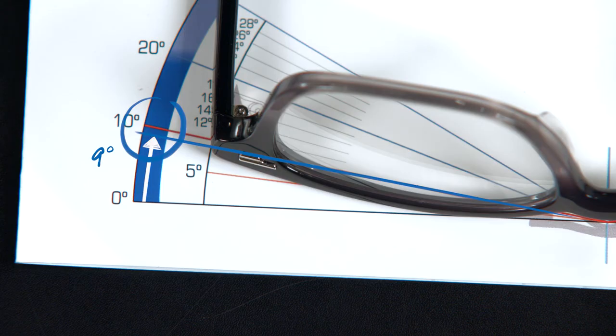The frame should have a positive wrap angle, meaning the frame should angle in around the patient's face with a measurement above zero degrees.